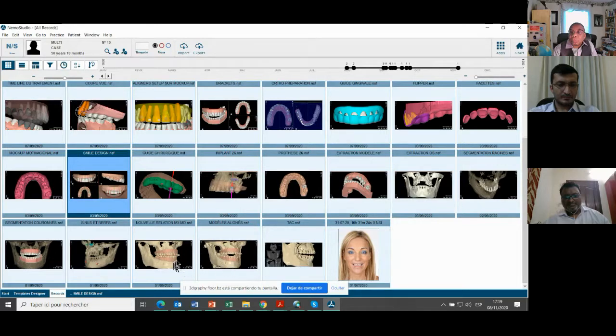I was able to also segment the bone, maxilla and mandible, and change the maxillomandibular relationship. And then I developed an implants case. I segmented the crowns, I segmented the roots also. I was able to do virtual extractions from the models or from the bone, even put prostheses and do implant planning according to the prosthesis. And I created the surgical guide, of course.